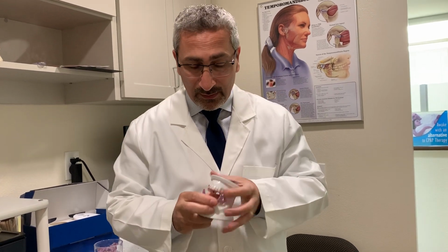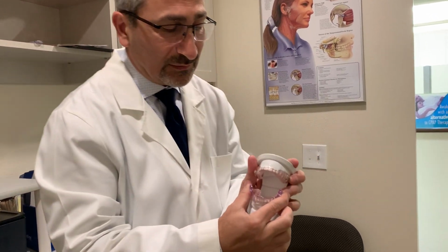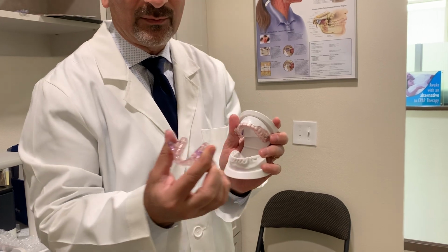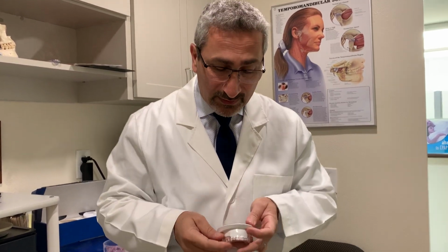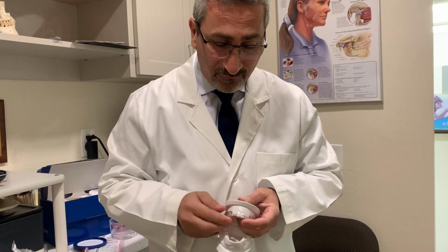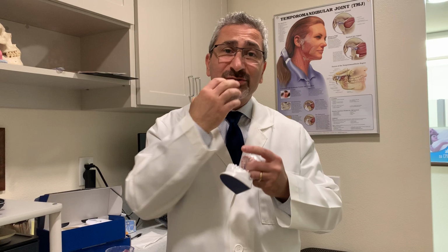As you remove it, you're going to use your thumbs at the molars and you're going to slowly wiggle it up. I'm not going to do it on here, but I will just slowly wiggle it up from the back and it comes out. And then you're going to take your index fingers, go to the way back to these bumps and slowly wiggle it down to pop it out from the back. If you pull from the front, most of our teeth are angled forward and it'll put a lot of pressure on your front teeth, and that's what we don't want to do.